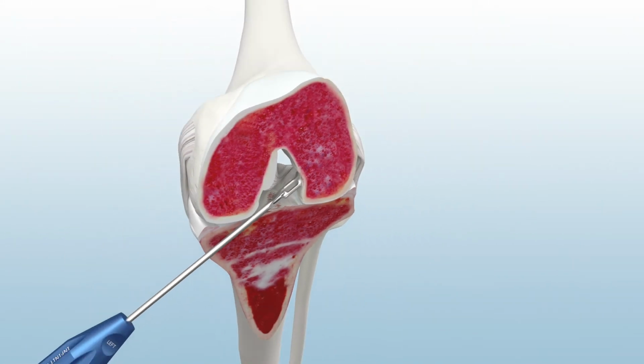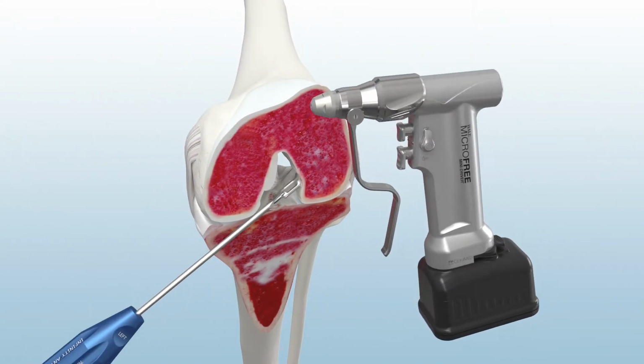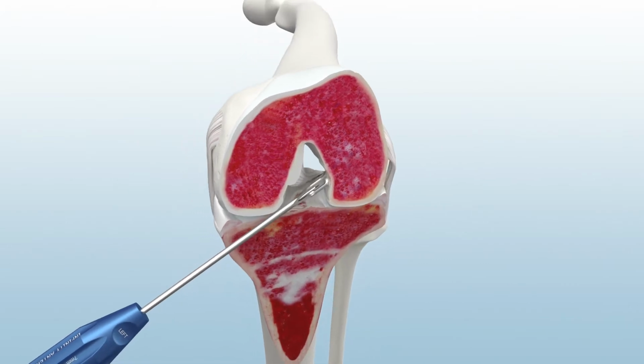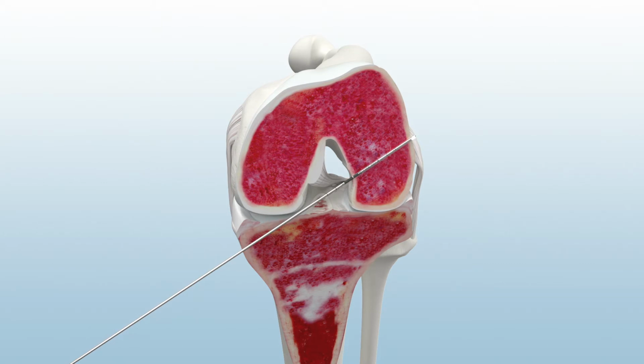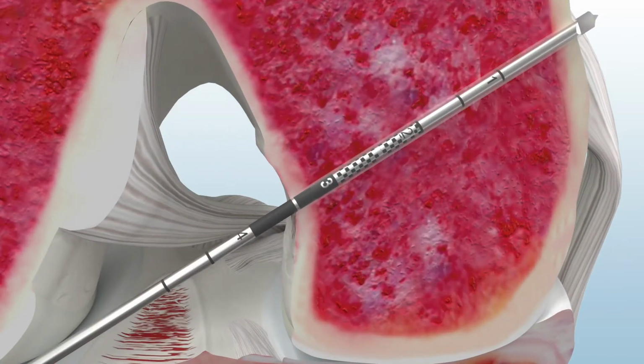With the guide still in place, use the Hall Microfree mini driver to advance the guide pin through the far femoral cortex. Then remove the guide from the joint and pull the guide pin back against the femoral cortex to confirm femoral aperture to cortex length. The spade tip guide pin's gradient pattern helps quickly identify AC length while under direct visualization.